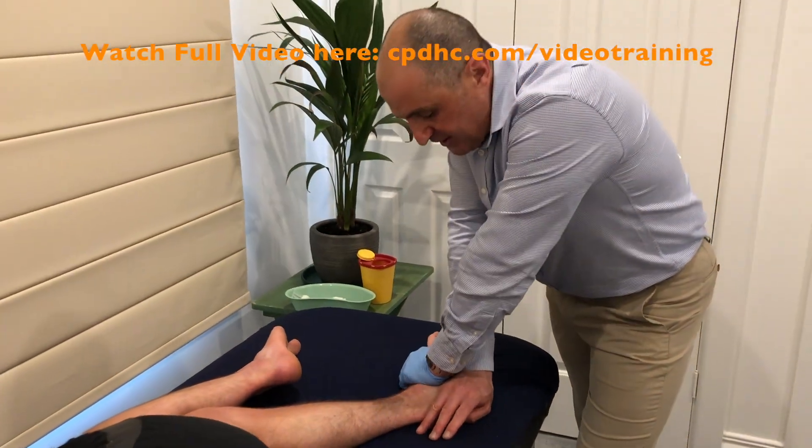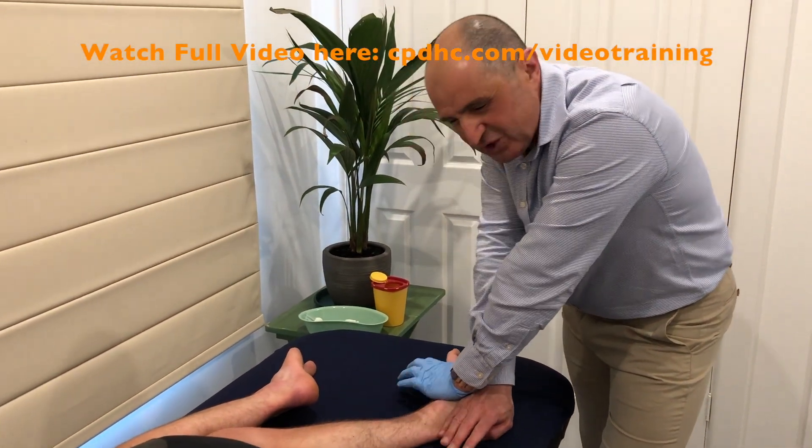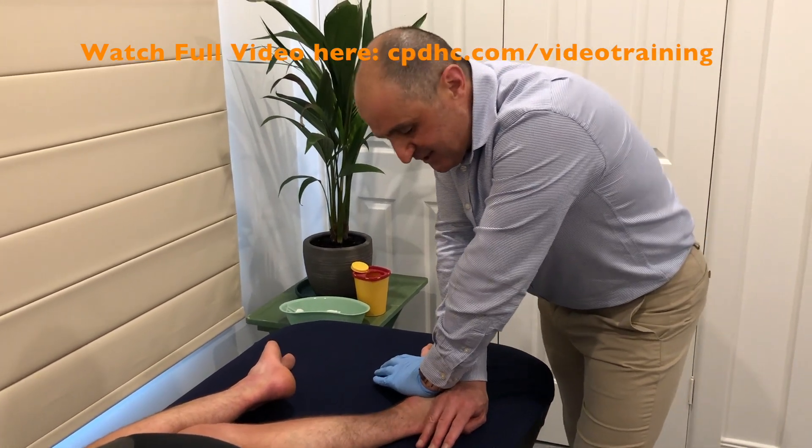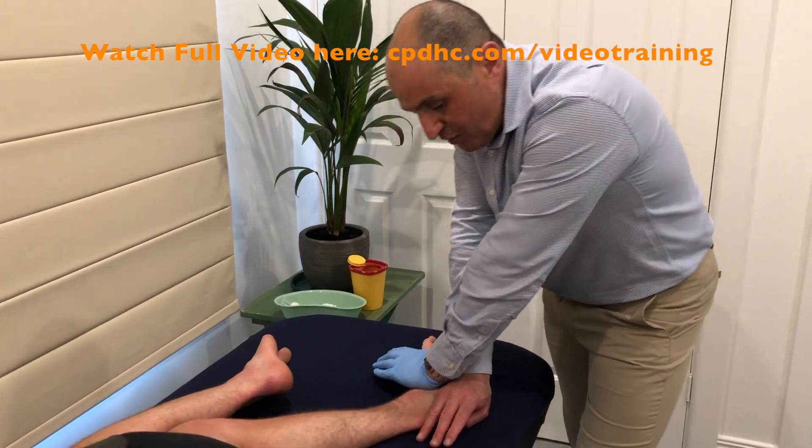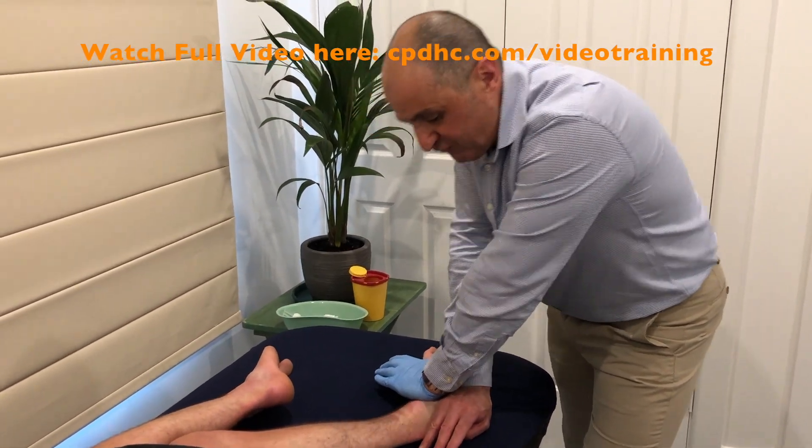Obviously this is the main problem — you get a lot of compression at this joint and it doesn't allow for much buffer because of those limited ranges of motion. So this is a great follow-up after you've needled the soleus for heel pain. Hope that helps.